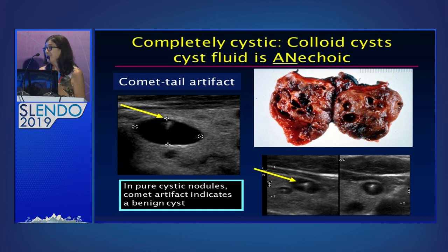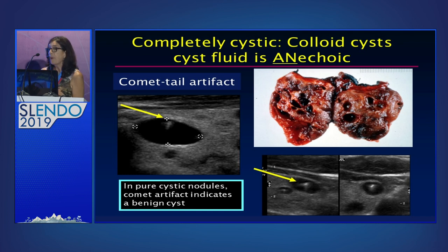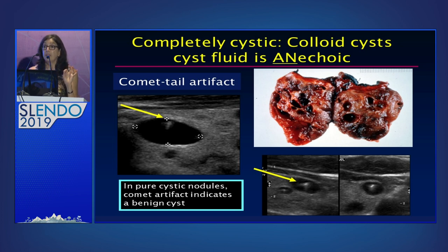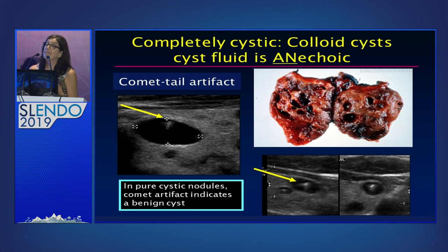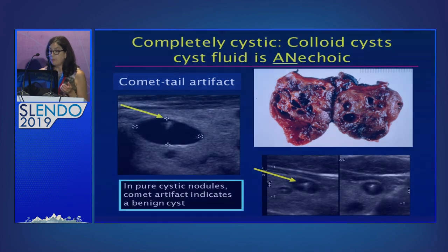Sometimes people talk about what is called comet tail artifact, which is a small smudge of brightness. That is a very benign finding, but only in a pure cyst. Comet tail artifact alone does not mean the nodule is benign, but if the comet tail artifact is in a pure cystic nodule, as it is here, this is a benign finding, and these nodules never need to be aspirated.